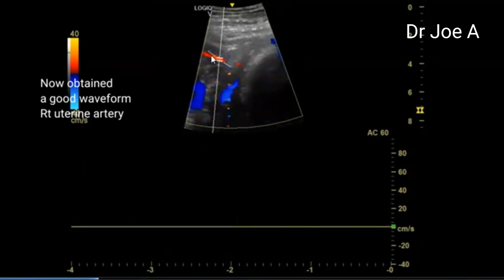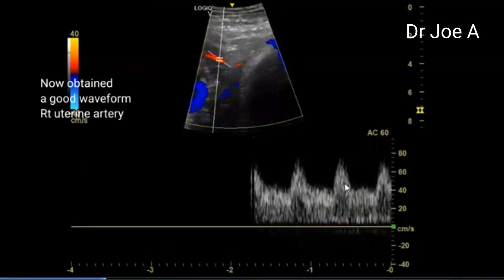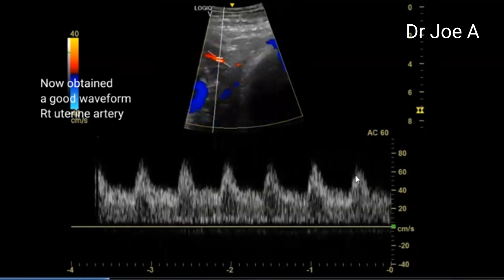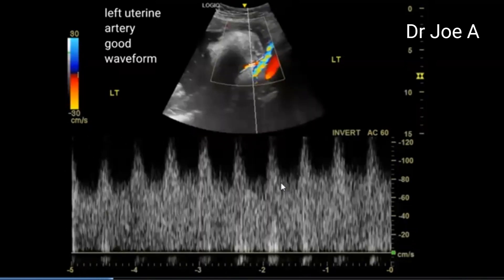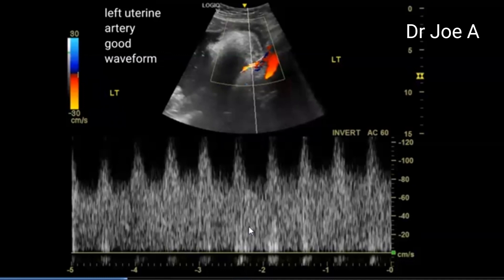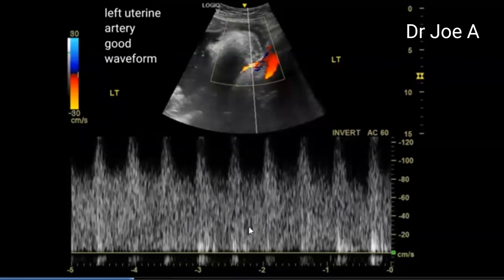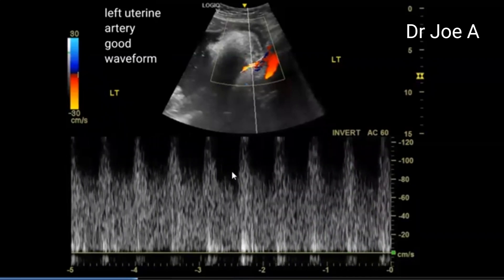The artery slipped out of view on the sample gate, so we tried again and got a good waveform. On the left side, we did the same thing and the waveform is good — very high diastolic flow, which is good. There is no real major abnormality in the uterine arteries, as we can say from this waveform.